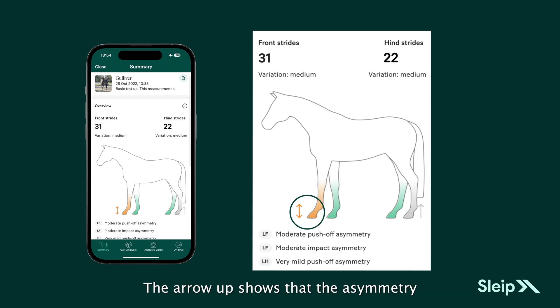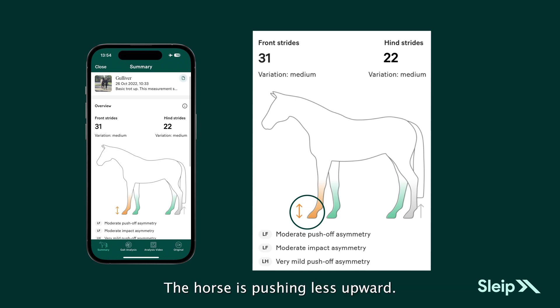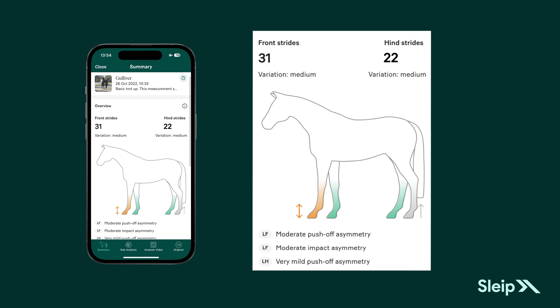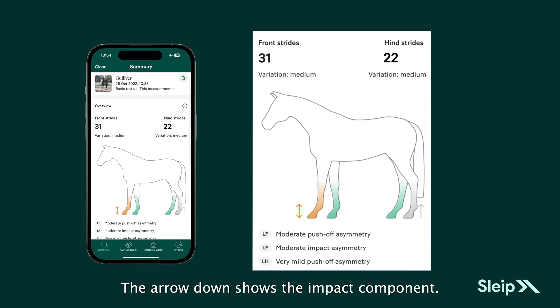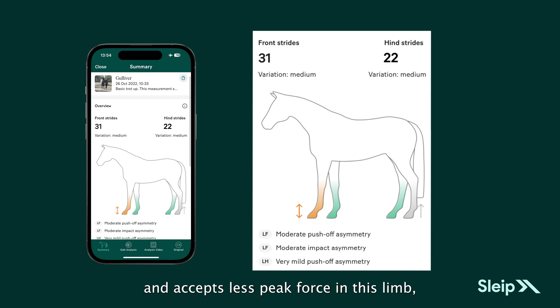The arrow up shows that the asymmetry has a push-off component — the horse is pushing less upward. The arrow down shows the impact component — the horse does not sink as low and accepts less peak force in this limb compared to the contralateral limb.